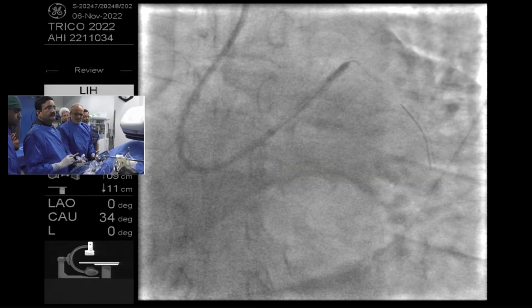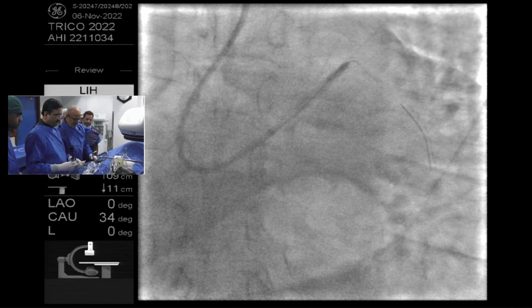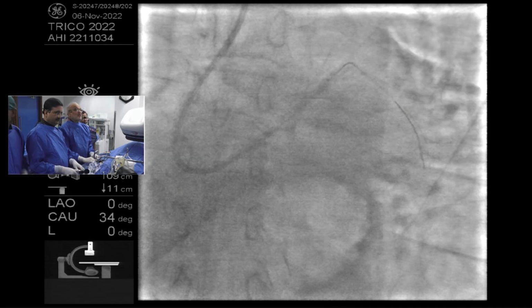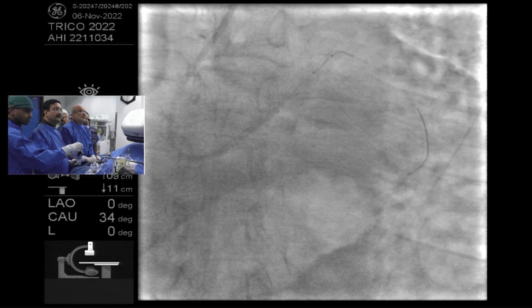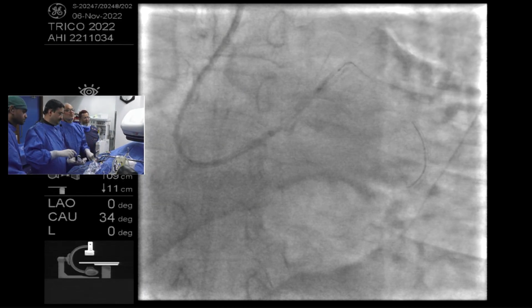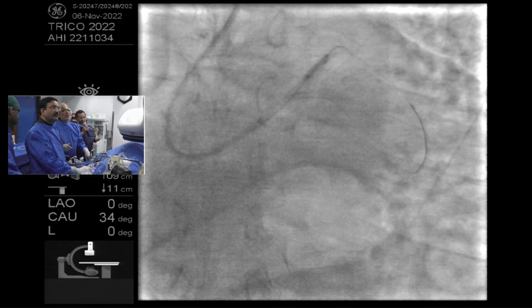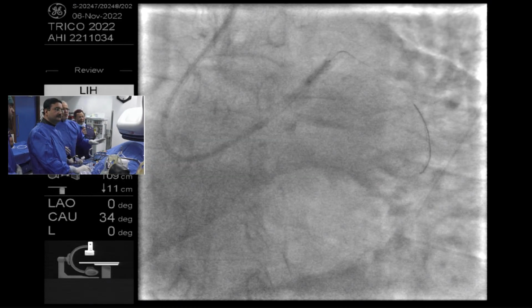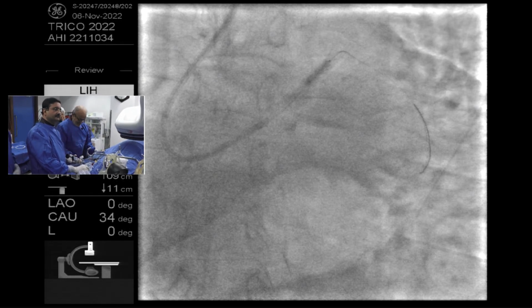I think coming to zero is also helpful instead of negative. I try to pull it. If it doesn't come, we'll go again. It will come out. It has come out, right? Yes. It has come after the second inflation in the same location. One thing is sure, that I am going to use all 80 pulses in this case.